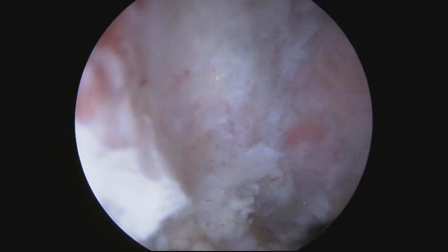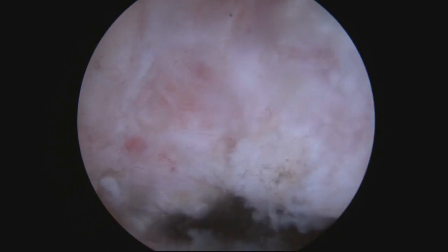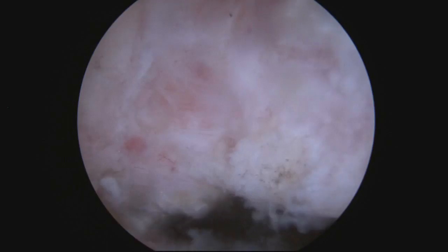You can see here the nice, even resection. Looks very nice and smooth, and there's a gap between the bone on the left and the bone on the right so that they no longer touch and cause pain. You see the gap right there? So, you're all done.